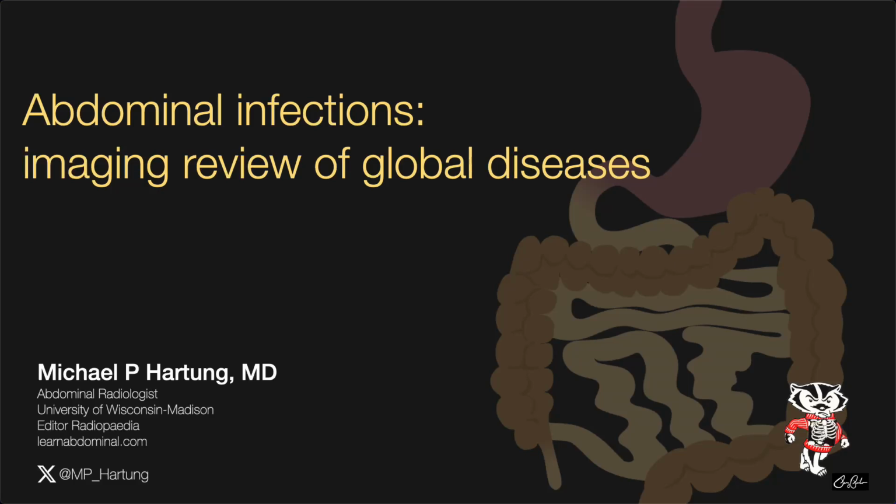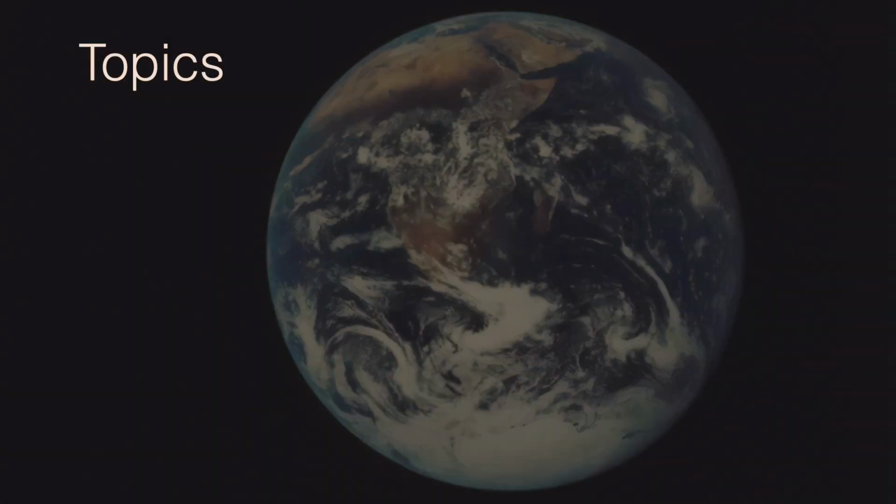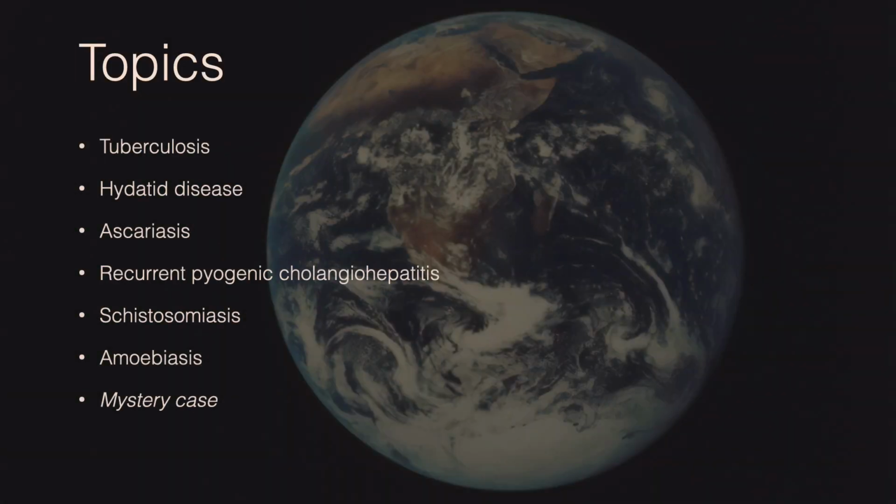Hello everyone, my name is Michael Hartung and I am an abdominal radiologist, and in this talk we are going to cover abdominal infections and specifically an imaging review of global diseases. We are going to need to travel around the globe to cover our various topics.